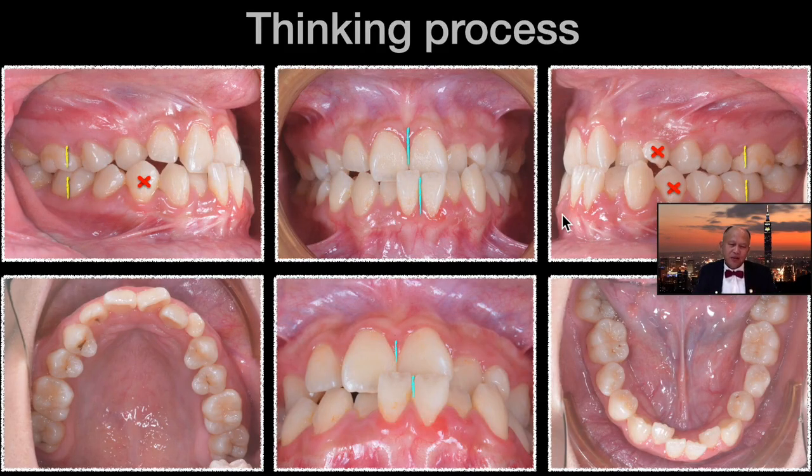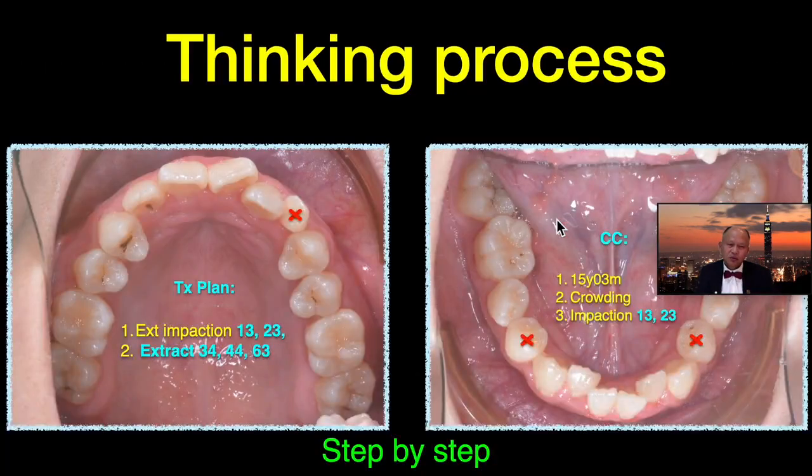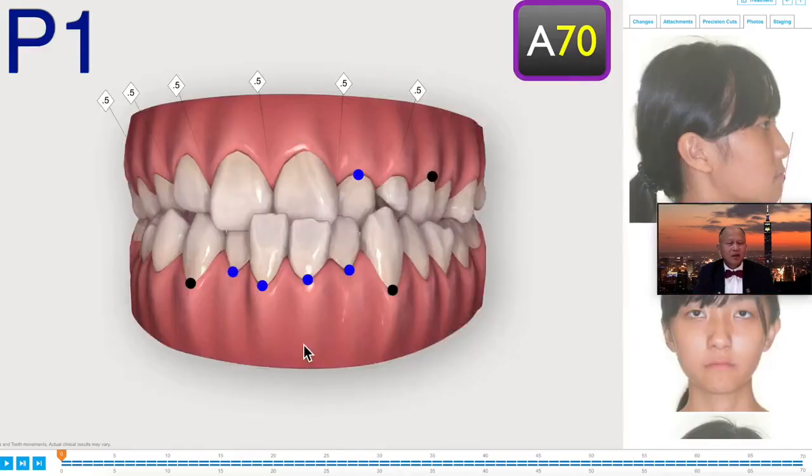If you want a 4-bicuspid extraction, why not do 2 lower first premolars to relieve the crowding, and on the top, you just take out the impacted canine. You're done. So our plan is to extract the upper impacted canine and the lower first premolars, to relieve the crowding and solve the protrusive lip.